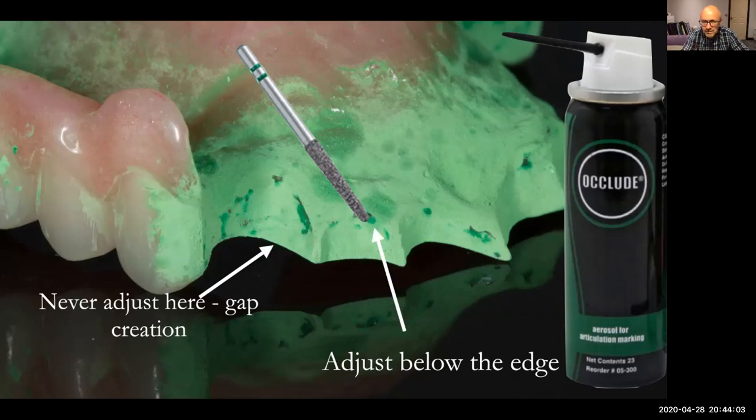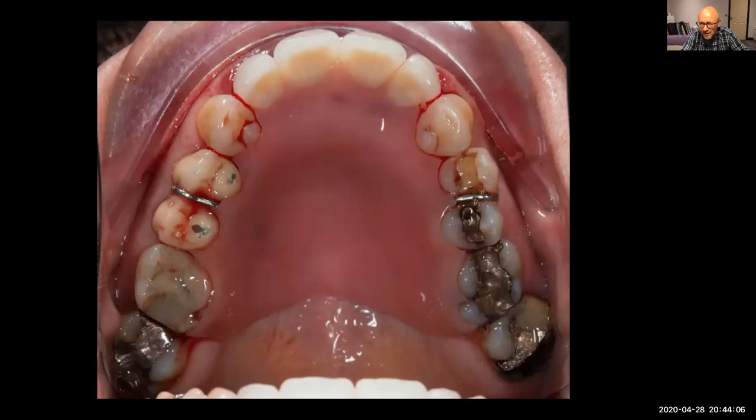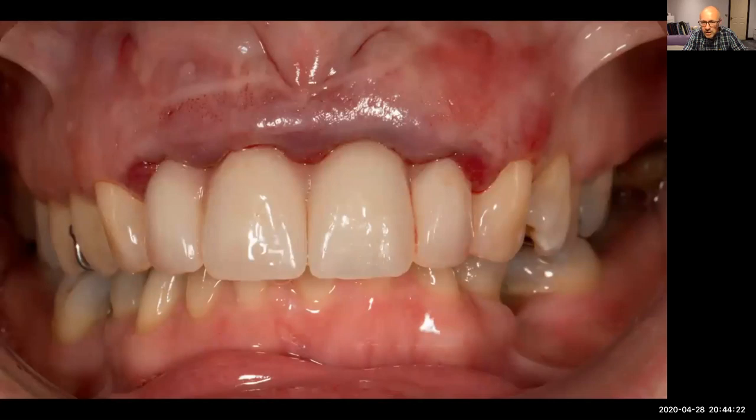And this means that my dentures fit like this. Here's Wendy's denture. Seriously, if you looked at any of my dentures, they all fit beautifully around the neck. So that will really help you when you get back into practice, that little tip. And there we are. It's all fitted down nicely.